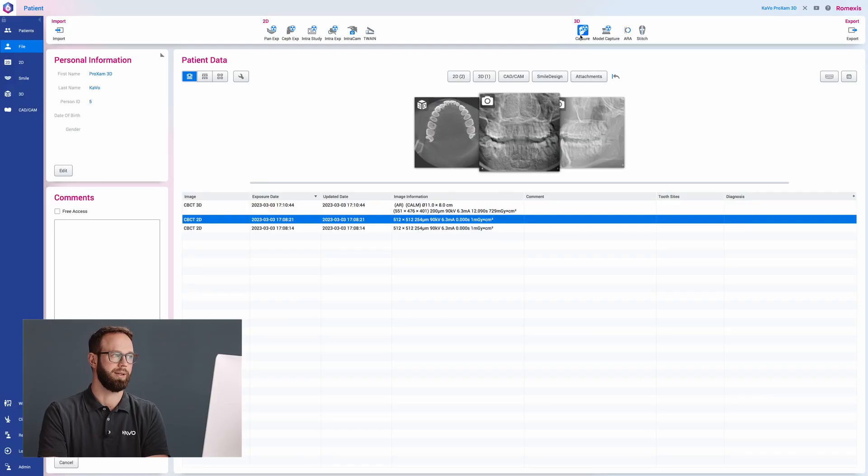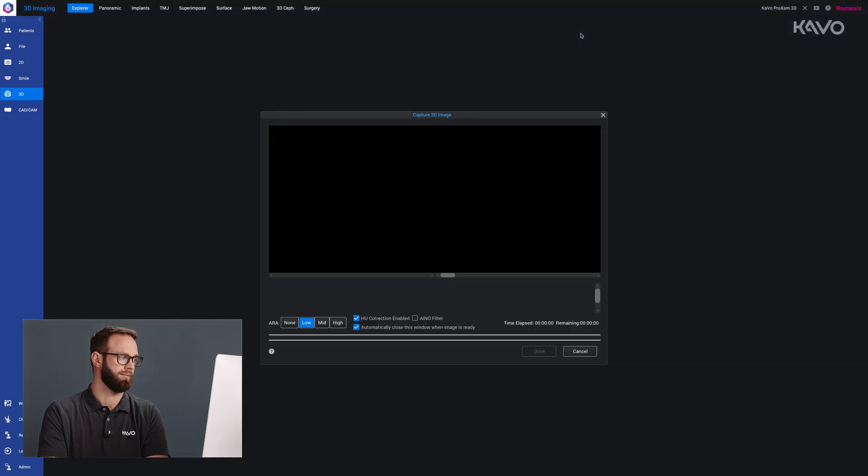To start imaging with ProExam 3D, we start by selecting the DVT button in Romexis. ARA allows us to select the level of metal artifact reduction as none, low, medium or high. This should be selected before imaging.